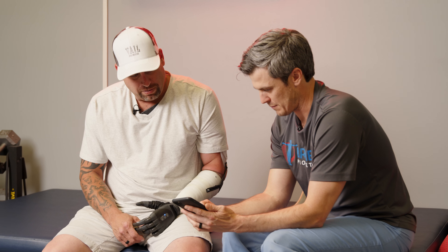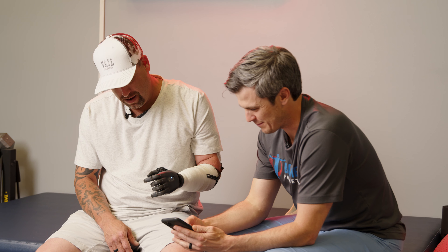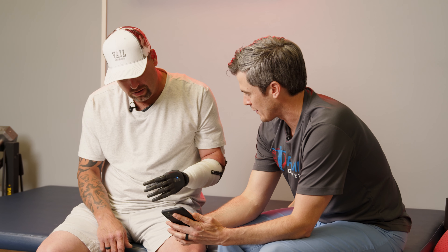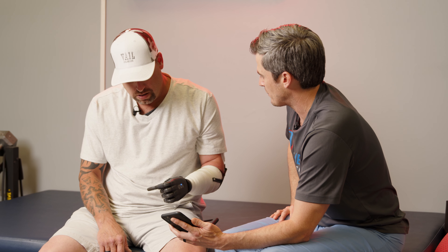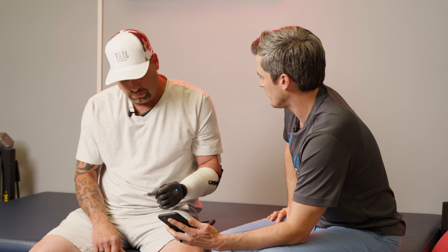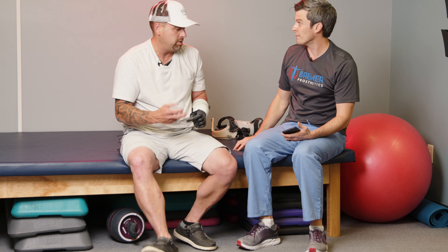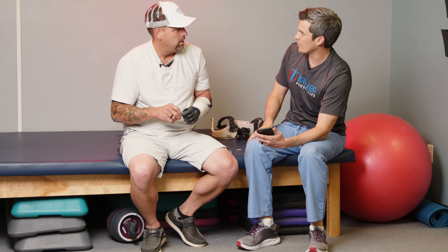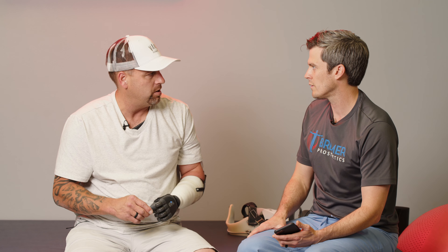Rock on. So we kind of talked about the one for — once you close it now, close it. Now open up — see how it does it. It's not going to let go of the drill. It actually works a lot better compared to that first one I had, which was so dang heavy. How's the weight? It's good. It doesn't really feel — it's manageable. It's not much heavier than the hook really. My hook actually is fairly heavy — the stainless steel. When you take it off it's surprising.